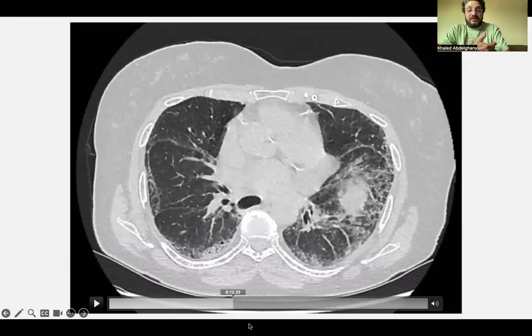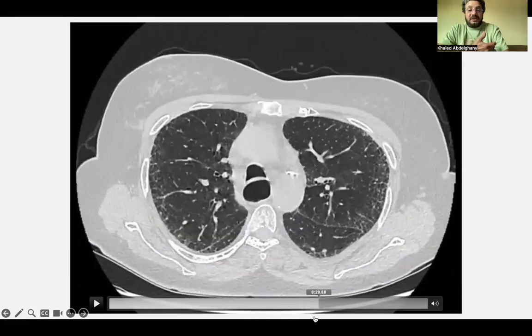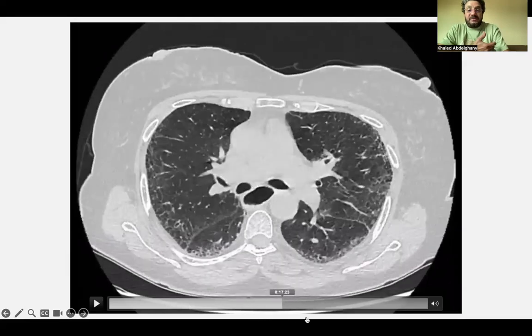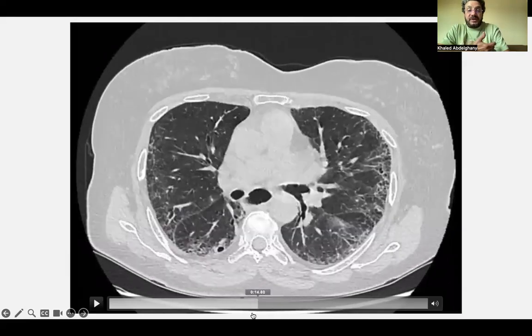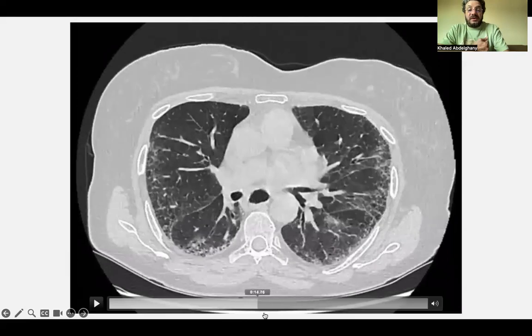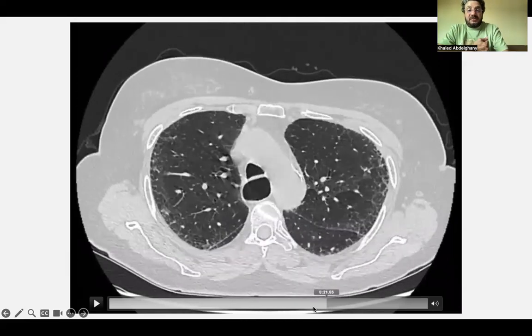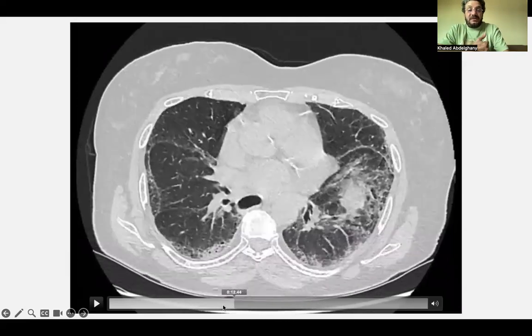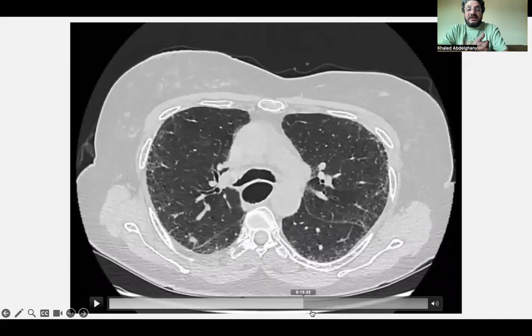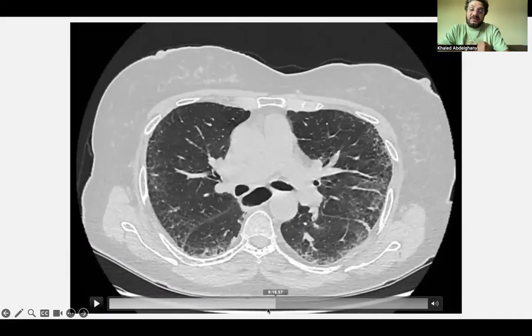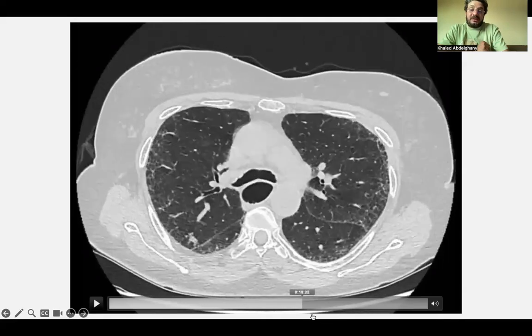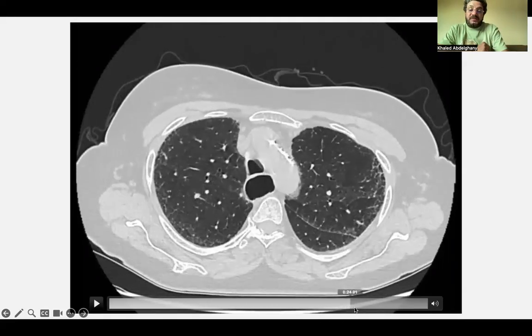There is also an apico-basal gradient, increasing from upward to downward in the lung. So this is a UIP pattern lacking honeycombing, giving us probable UIP. Presence of bronchocentricity would also deny probable UIP, which is not the case here. So we have probable UIP pattern.